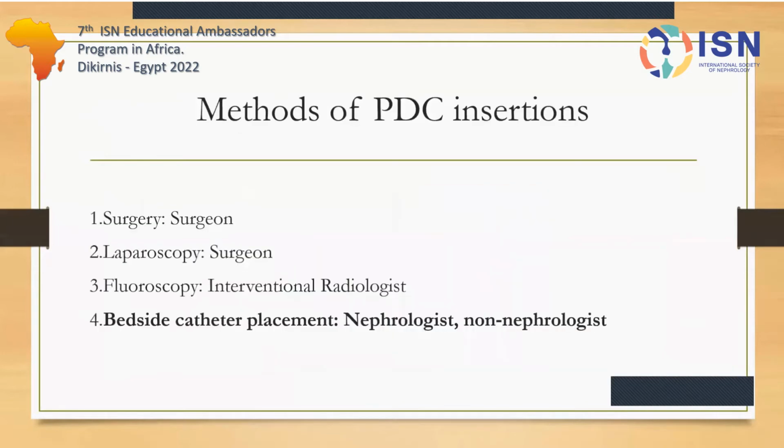Methods of PD catheter insertion, in broad terms: we can do it by open surgery and through laparoscopy, and recently interventional radiologists have also joined the field of PD catheters, and they can now place this catheter effectively with the help of ultrasound and fluoroscopy.